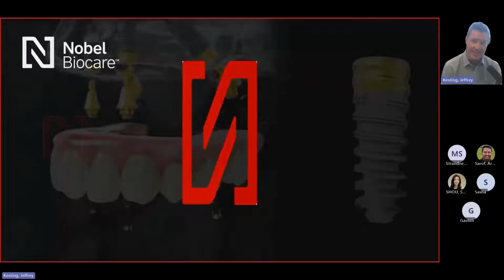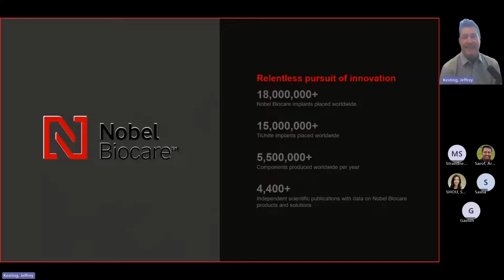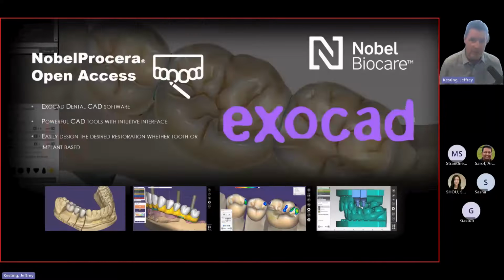The focus of our webinar today is going to be exocad, but just quickly, a little brief background about NobelProcera. Some of these numbers you can see here with implants placed worldwide. These are going to be even more than this now. So this slide is probably from a little while ago, so these numbers will be even higher. The point here is we really have more experience, more science in the industry than anyone, and these implant-based restorations, implant surgery in general. And what we can really do with that, with a powerful tool like exocad CAD software, is we can design our NobelProcera screw retain restorations, and we're going to talk about that as well. Our focus will be exocad here, designing NobelProcera custom restorations.